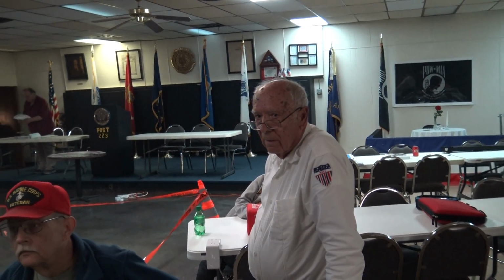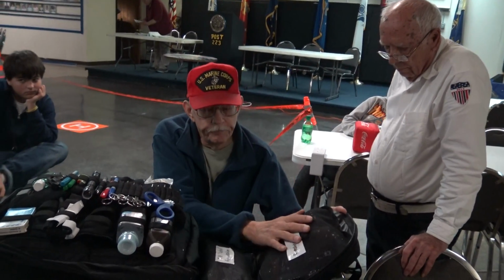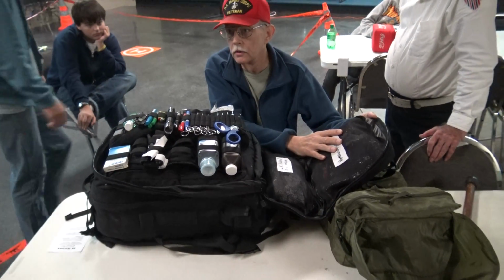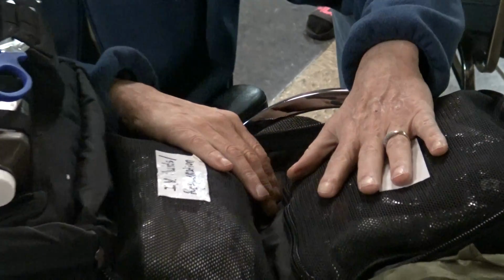I was just gonna say, I wanna see what's in the rest. Are you gonna show us the rest of the bag? Yes. Okay. This part here is for fractures. Okay. I've got SAM splints and stuff like this, and a variety of other things.